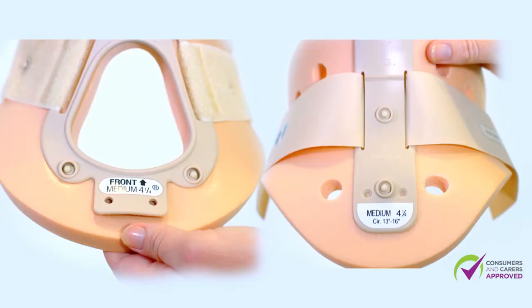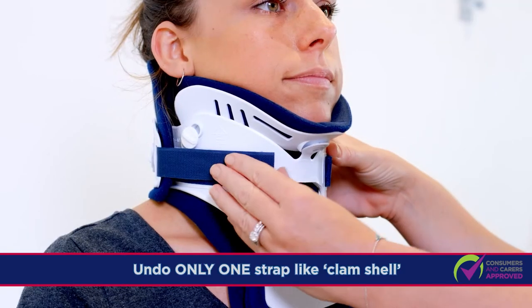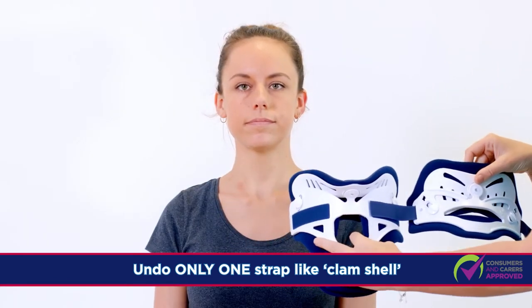There are labels and arrows showing the correct direction. Tell the patient not to move their head at all times. Undo only one of the Velcro straps of the Miami J collar front piece to open up like a clamshell and remove the collar completely.